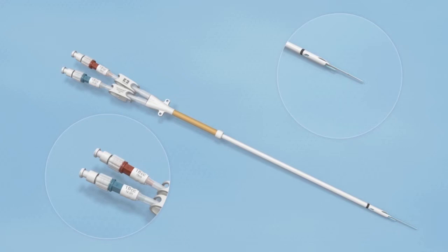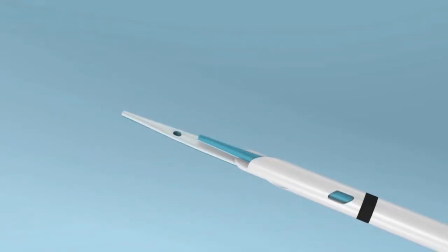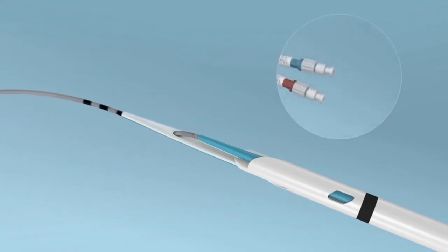Note, if preparing the catheter for tunneling, unlock the stylets and pull distally at least 8 centimeters to facilitate attaching the tunneler. When tunneling is complete, attach the guide wire. Flex the tip of the longer stylet 45 degrees to assist the guide wire exit. Thread the guide wire 1 centimeter into the distal tip of the longer stylet such that it exits the stylet side hole. Continue threading the wire into the distal tip of the adjacent shorter stylet until it is seen emerging from the back end. It is important to wet the wire for ease of advancement.